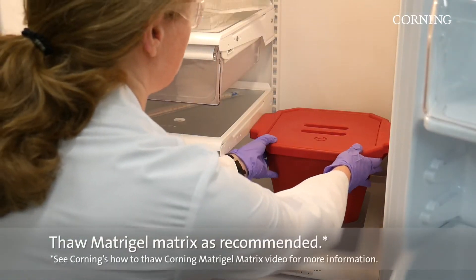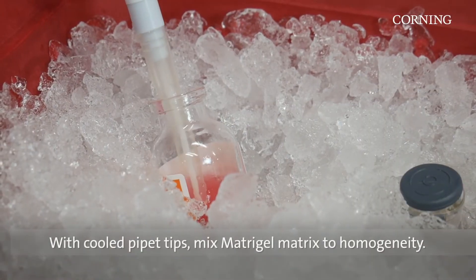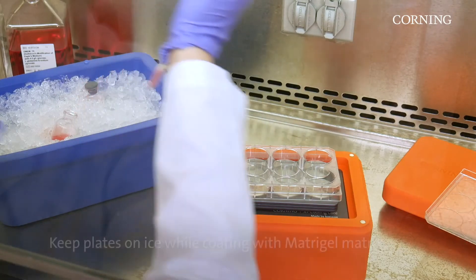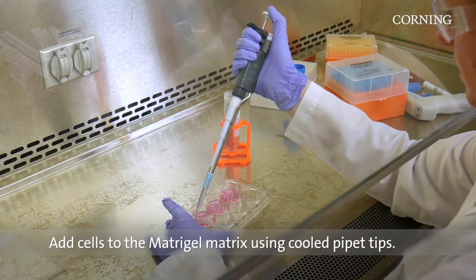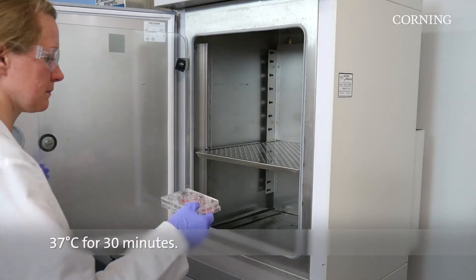To use this method, thaw the Matrigel Matrix as recommended. Using cooled pipette tips, mix the Matrigel Matrix to homogeneity. Keep cultured plates on ice and add 50 microliters per square centimeter. Add cells to Matrigel Matrix and suspend using cooled pipette tips. Place plates at 37 degrees Celsius for 30 minutes.